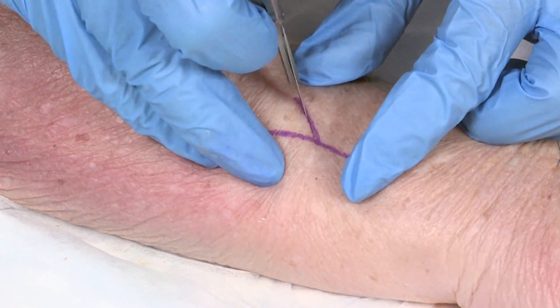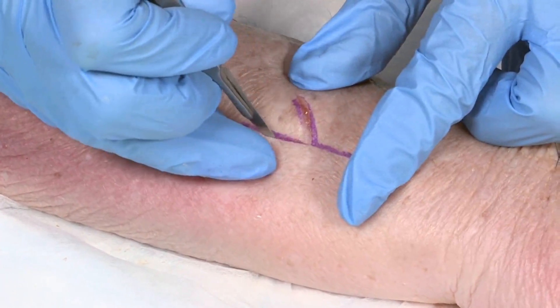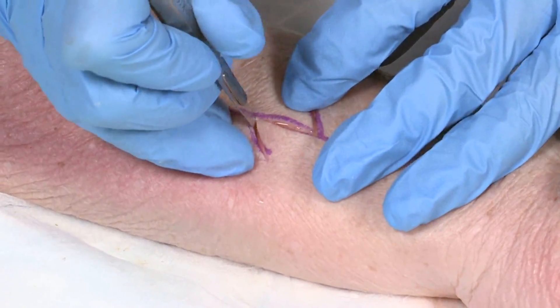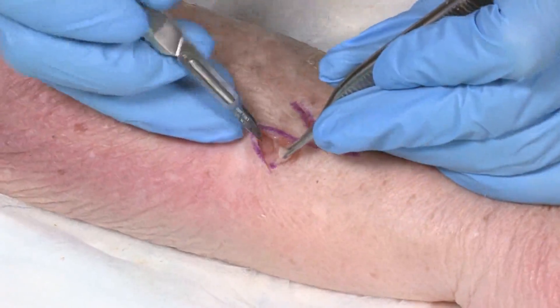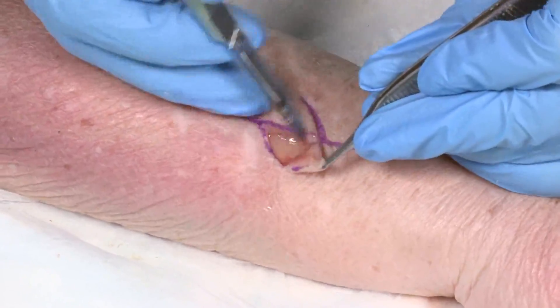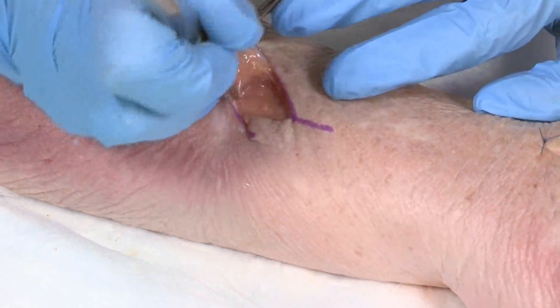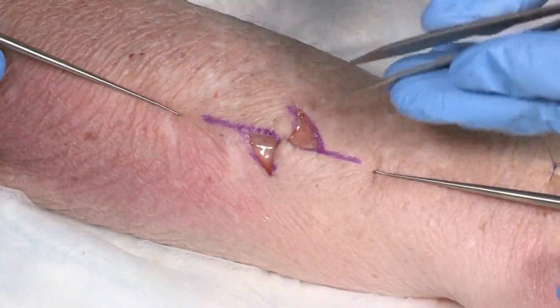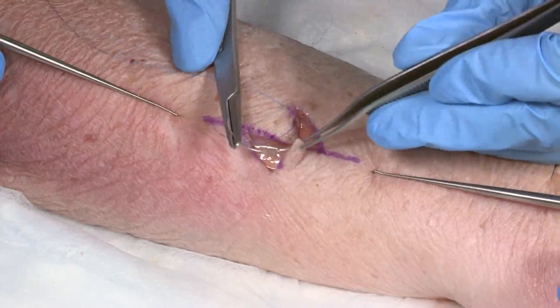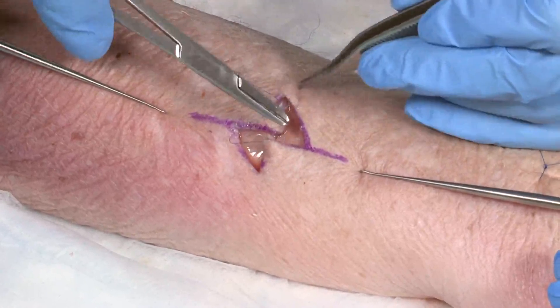An incision is then made along the marked Z. The triangular flaps are undermined by careful dissection and then transposed. The first stitches are placed at the corners of the triangular flaps to secure the transposed flaps in place, and the remainder of the wound is then carefully sutured.